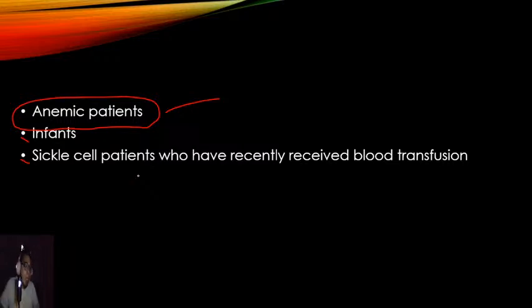That way we can have more cells to react and to induce a hypoxic environment, because the problem, especially if you're using turbidity methodologies, is that there's not enough cells that would be lysed, and therefore you wouldn't see the turbidity that is accentuated as a positive result of the test. So you need to have a certain amount of red blood cells to react.